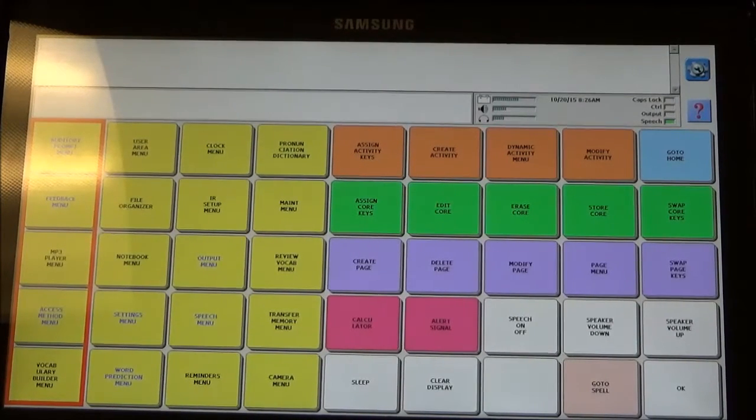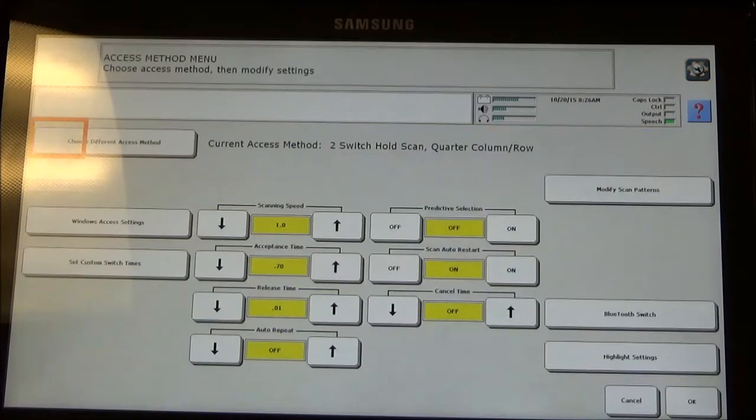Now with the left hand, the blue, I hold and I let go. With the right hand, the red, now it's going to go down. There we go. And now I select this with the left. And here we are. All right.